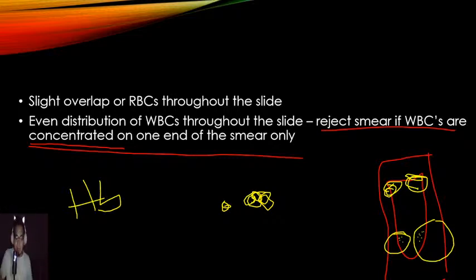So yung mga estudyante ko, ang ginagawa, dinadagdagan ng blood dun sa kabilang side. Okay? Which is a big no-no, ha. Huwag niyong dadagdagan dun sa side. Totoo. Nakita ko yun, mga UST intern ko yung gumawa. Sabi ko bright talaga tong mga student ko, mga UST intern ko na to.